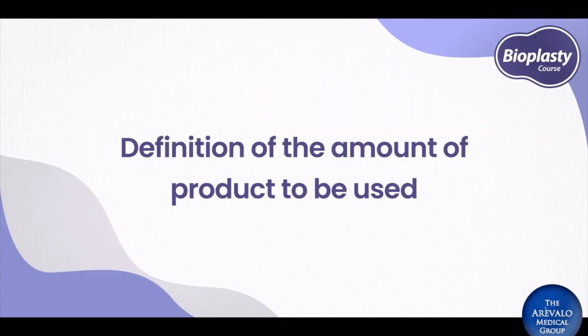When doing the syringe distribution, the application follows the logic of centrifugal force. The amount of product to be used depends on the musculature of each patient. The average that is placed in a safe application is around 150 to 180 ml on each side, and can reach 240 ml on each side in larger muscles. The doctor is the one responsible for deciding the amount of product to be used, not the patient.